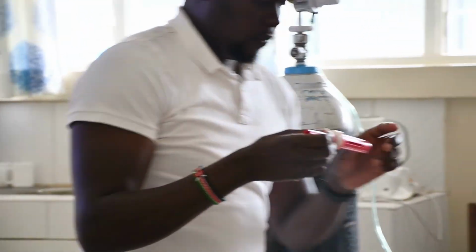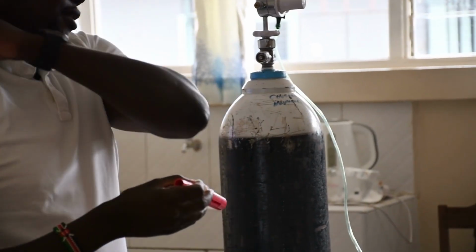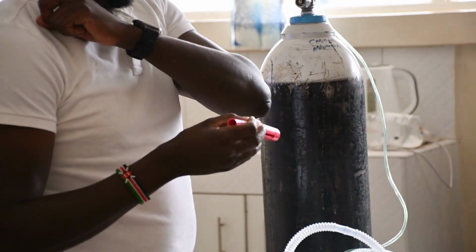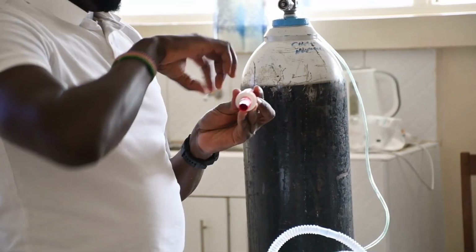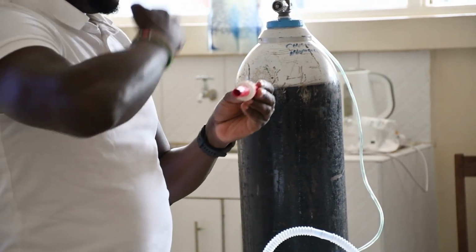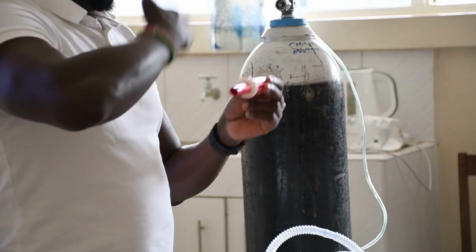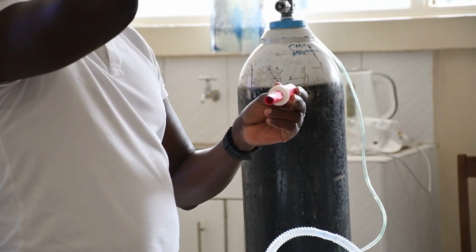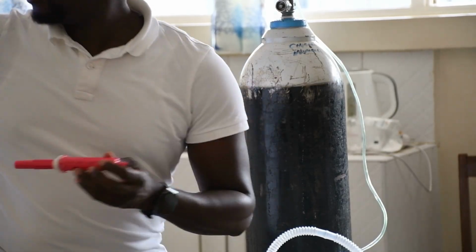Inside this blender, because of the high velocity of the gases that are coming in, it's going to be a low pressure zone inside, and outside is going to be a high pressure zone. So the gases from the outside will only be able to flow into the blender as it escapes on this end.